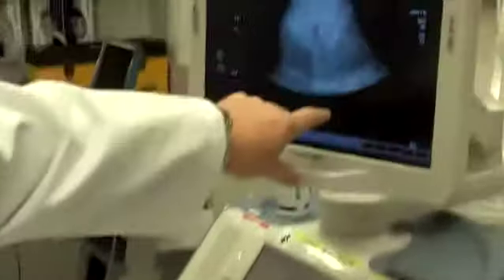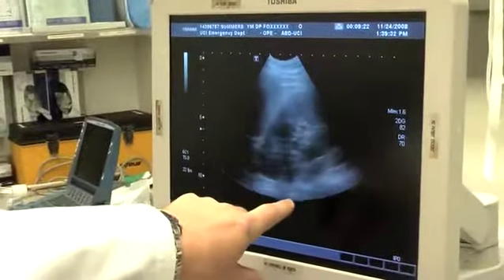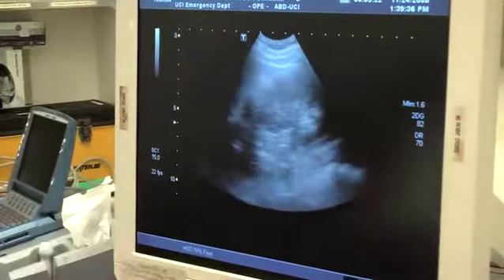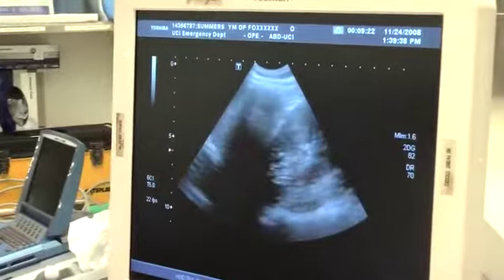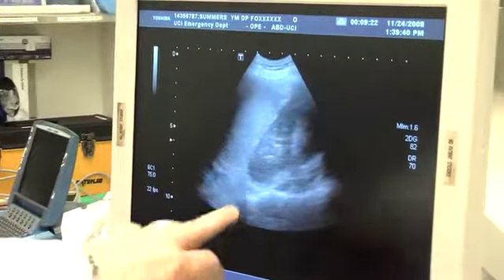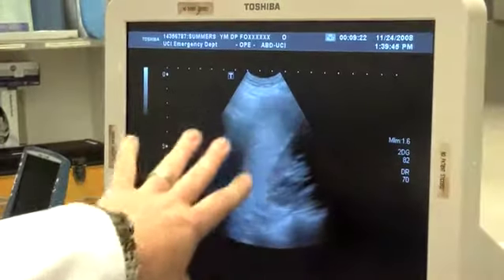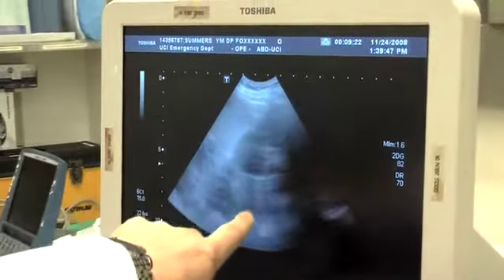If I go a little bit more caudal, I'll get her entire kidney, but sometimes these ribs can get in the way, and you can have a patient take a deep breath, and that'll bring the rib shadow out of the way. Take a deep breath for me. Look how nice the splenorenal view is. There you can see there's no fluid in that space.